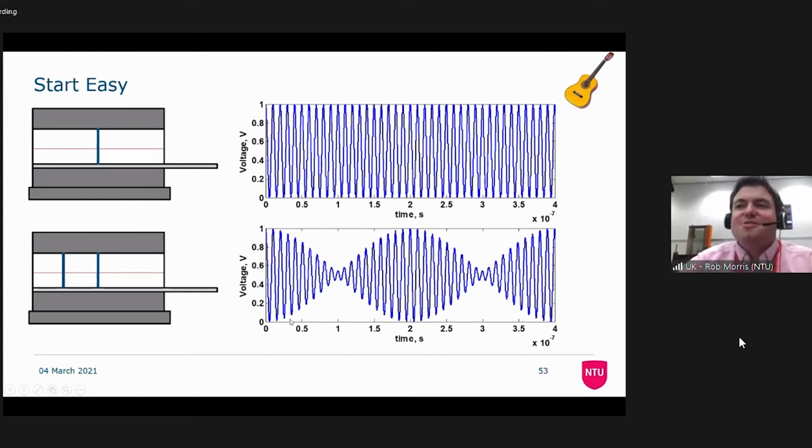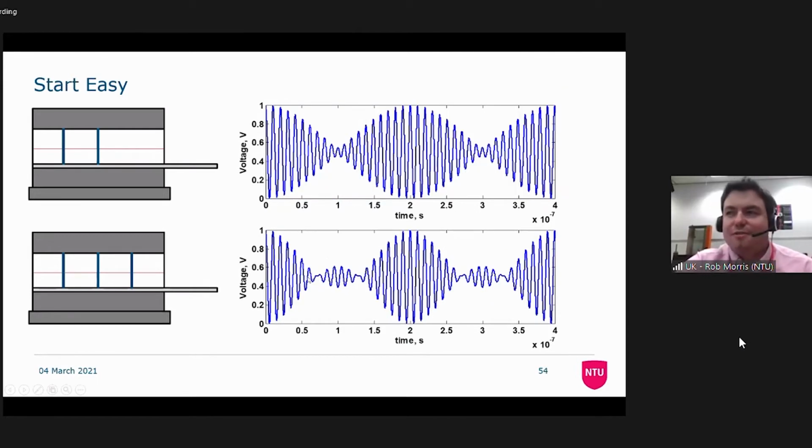But unfortunately, it's not what happens. When two signals are really close together, they interfere with each other, and this interference is what we see. The actual envelope of this plot that you can see on here is this beat frequency interference. So unsurprisingly now, hopefully, if we put in our third disk, it's just going to give us more of this weirdness and change our shape entirely again.